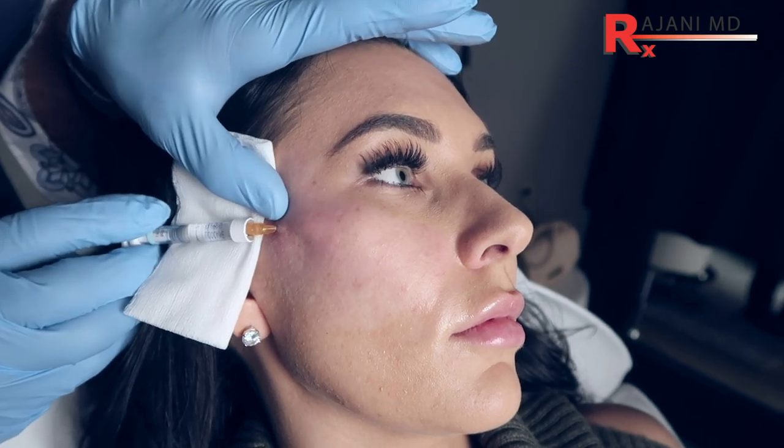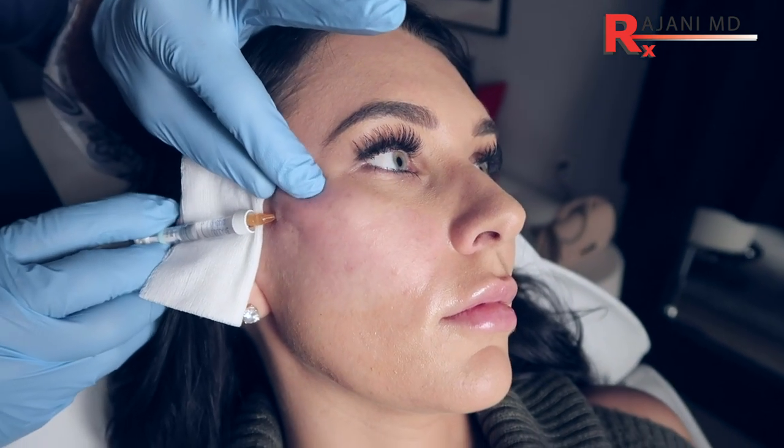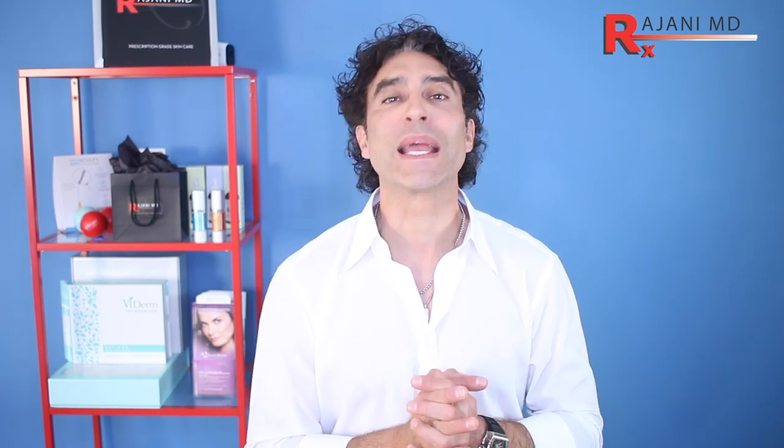Keep the cannula clean. You can put a sterile four-by-four, or apply hypochlorous acid or even alcohol — something to make sure you have a clean gauze to cover the hair and give yourself a clean zone to work with. It is a long instrument and you are going deep, and these problems can come up months and even years down the road. If the cannula gets dirty, discard it — they're five or ten dollars, well worth it.